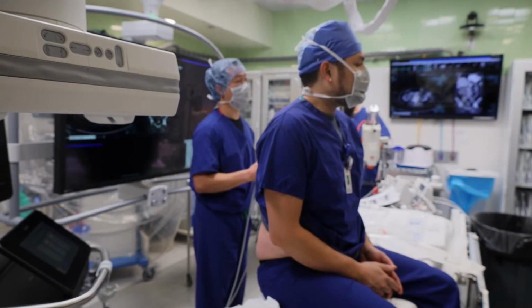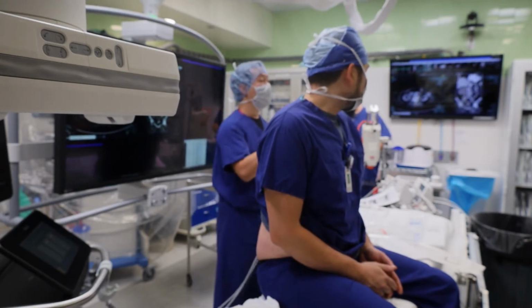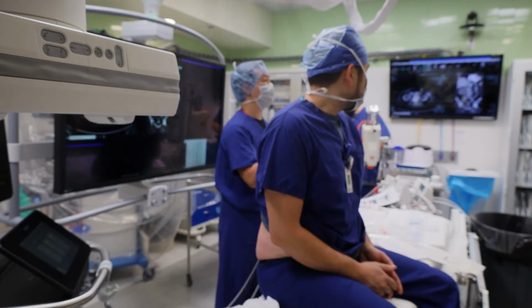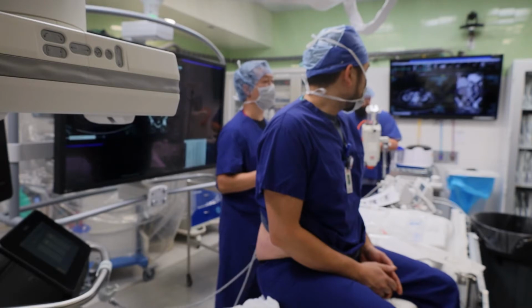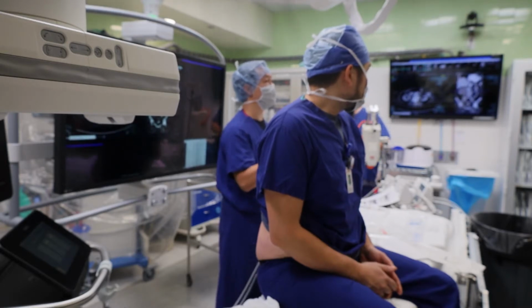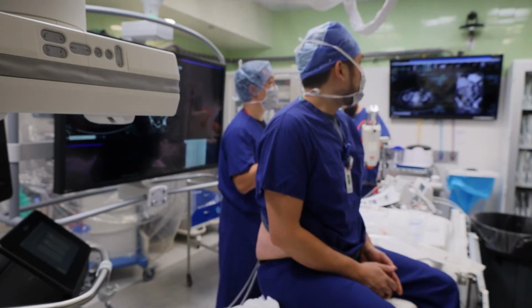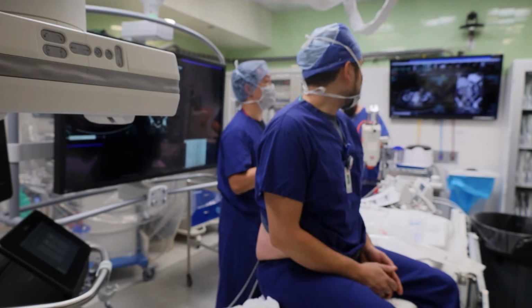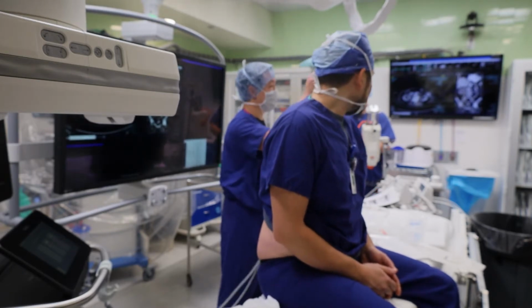If you're sonar technologists, that's all old news. Anyway, the reason for that is that higher frequency dissipates very fast. The loss of energy occurs much quicker than low frequency. However, higher frequencies have much higher spatial resolution than low frequency. So when we target small things, blood vessels, when you place a PICC, when you're looking at shallow things in the neck, we use this.